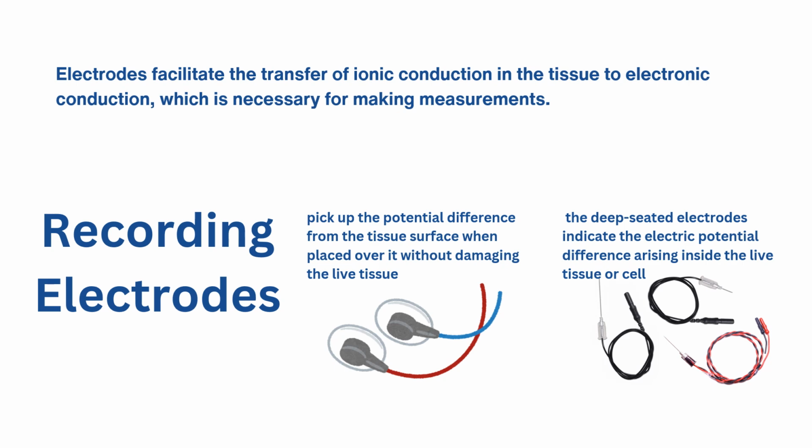In our case, we will be using this electrode to transfer ionic conduction in the tissue, whether it is under the skin, or in 90% of these cases it is under the skin. So from the tissue and ionic conduction, there's a transfer of ions to the electronic conduction through the electrode to the measuring device. So we will have this ion transfer. This transfer of ions, when we learn, when we manipulate, we can understand a lot of things, right? So doing this is actually the electrode, which is a pure conductor.